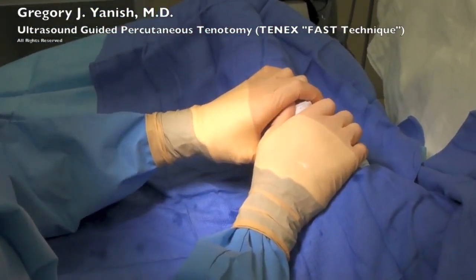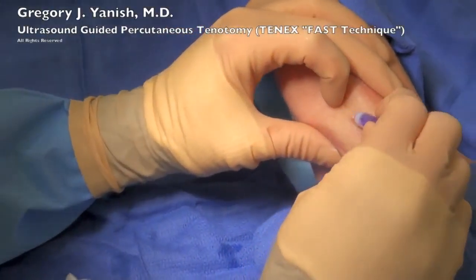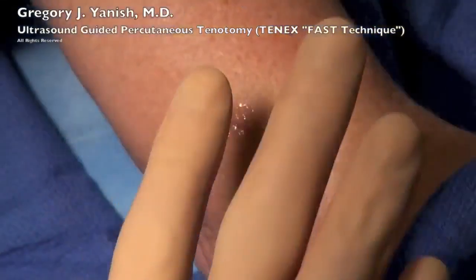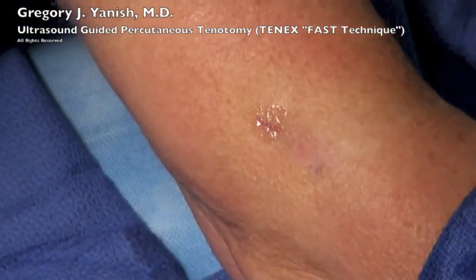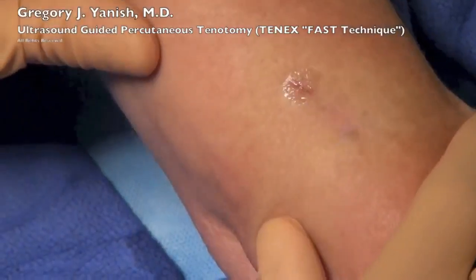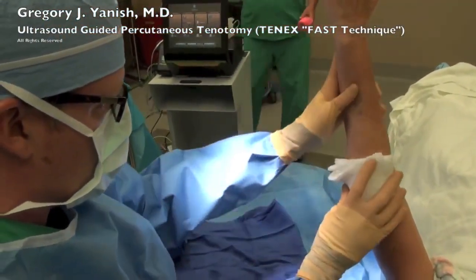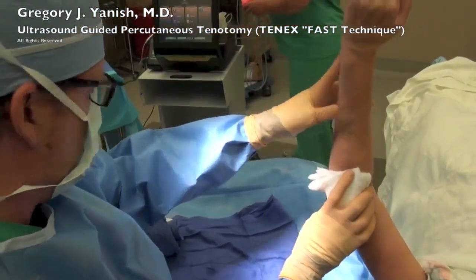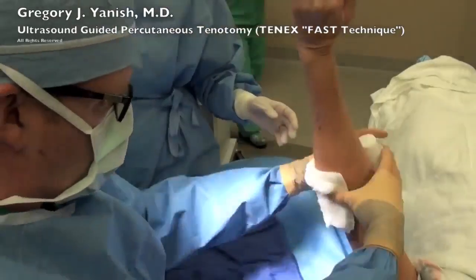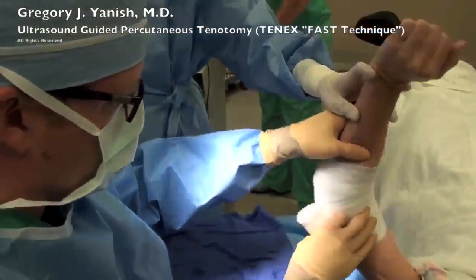Get this area nice and dry, and then I apply a small dab of Dermabond, which is very similar to superglue. One little dab will seal the wound. You can see how small that is. And then we'll place a sterile compression dressing, which puts just a little bit of compression on this area, keeping some of the swelling down and also covering the wound.